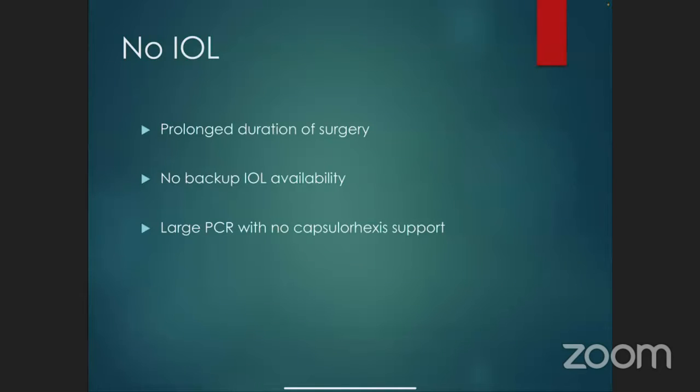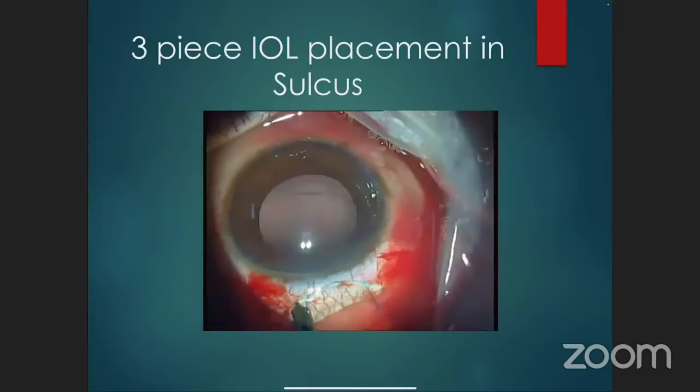So, when do we leave the patient aphakic? Prolonged surgery, no backup IOL available, and not enough support. Coming to the first part, IOL placement in the sulcus.